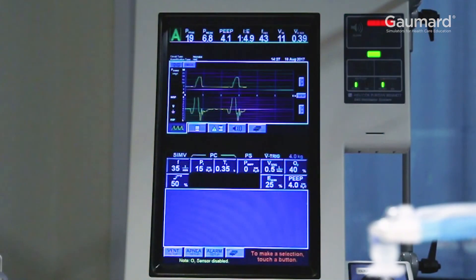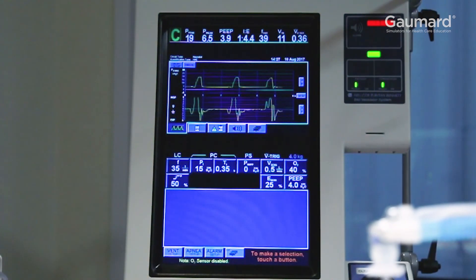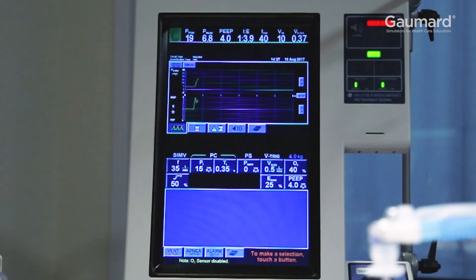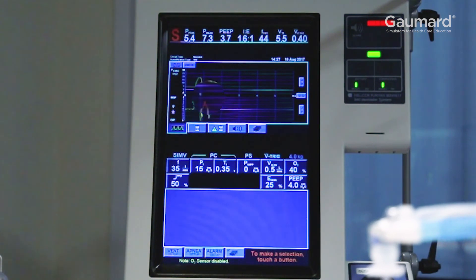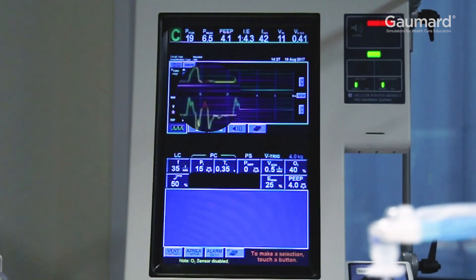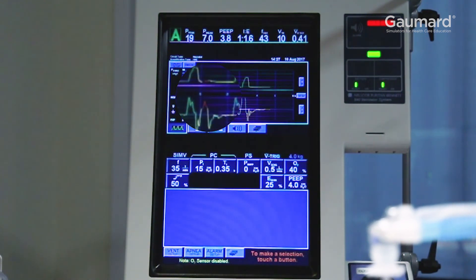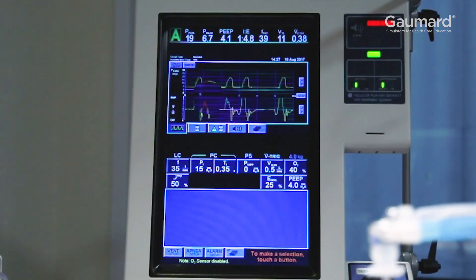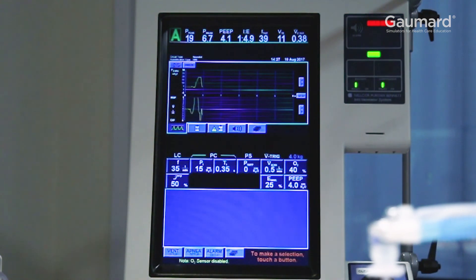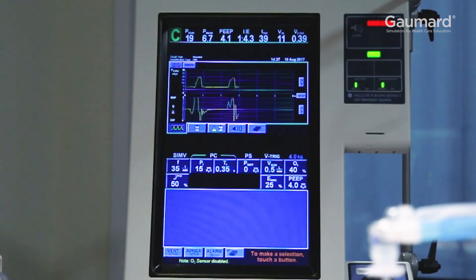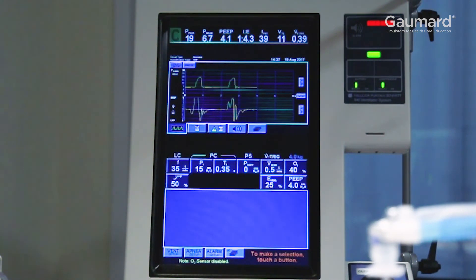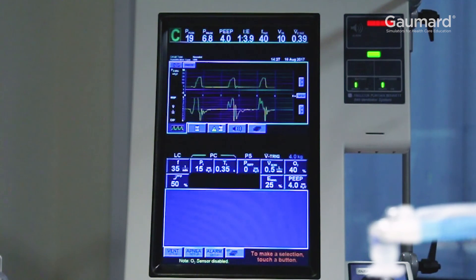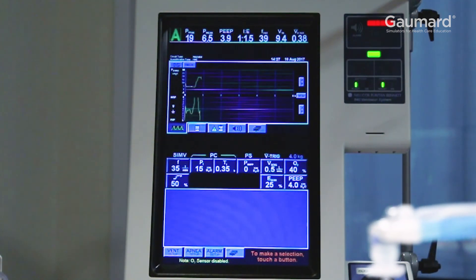In the synchronized spontaneous setting, SuperTori will take small inspiratory gasps at the rate specified in UNI. These small gasps can be detected by real mechanical ventilators as an attempted spontaneous breath. In the appropriate ventilator mode, these gasps will be assisted with pressure or volume support.